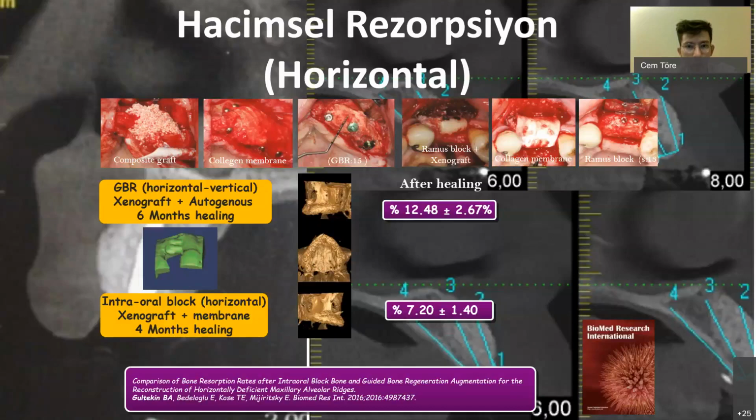It's worrying for the patient to say, we will remove a block of bone from your jaw and put it to another part, and just say, okay, we will now in the beginning make an incision in this area, and then we will shave a bit of bone to mix with our bone dust, as we say in Turkish, at least, and then it will be placed on the receiving side. The patient is much more accepting of the bone shaving collection with the GBR, the bone scraper idea.